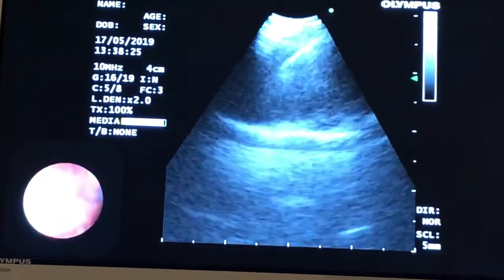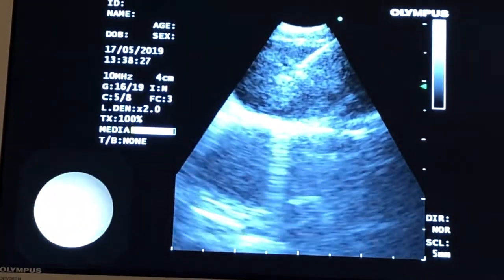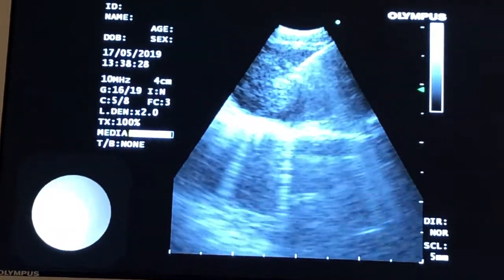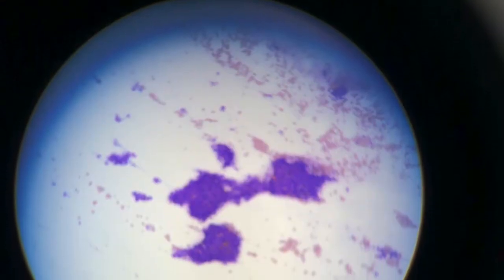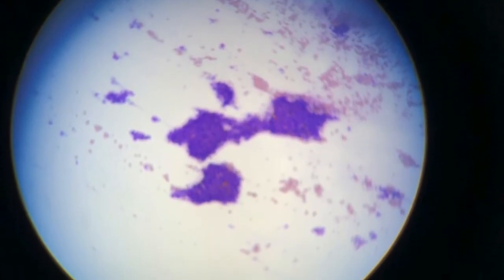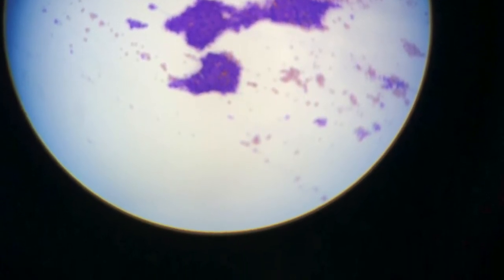As the needle goes in, it pushes the ultrasound image away so you lose the image momentarily. But there you can see the needle within that — the on-site cytology from the 4R lymph node TBNA. On-site cytology of that sample that we took.